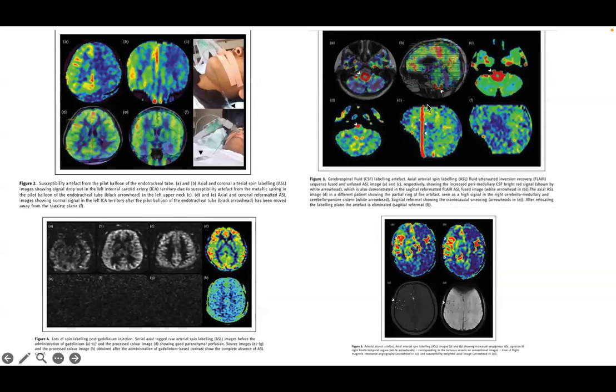And this is called a smearing artifact, which is when along the Z direction, that is the superior inferior direction, there can be a smearing artifact. If you look at only the axial images, you will think that there is some focus of hyperperfusion, because on axial it will look like one area of hyperperfusion. You have to reformat and see whether it is an artifact. This is called a smearing artifact, which we also have. A lot of physics explanations are like that. Gibbs ringing is producing this. We had a tussle with Saharchuk. He gave an entirely different explanation for that. But his explanation, I don't think it was correct.